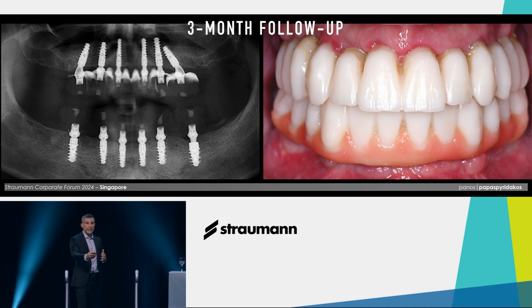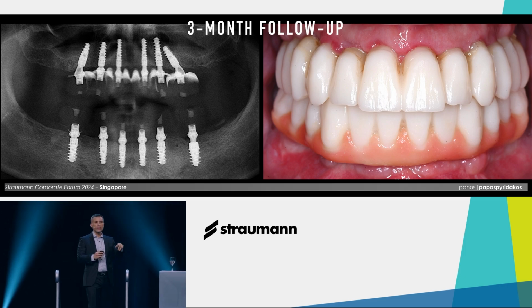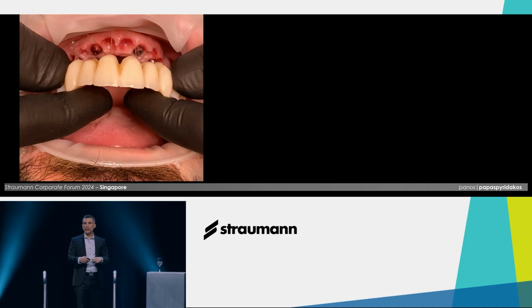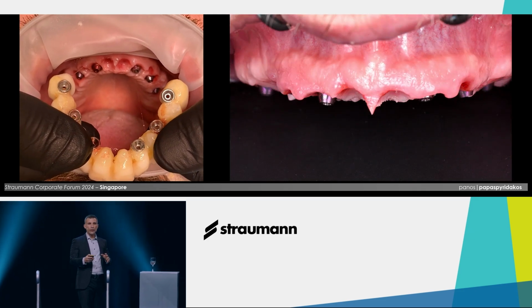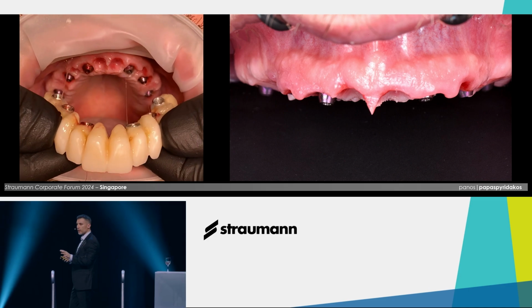So first we will take the dentate scan of the provisionals, as you see. Also appreciate the power of provisionalization and soft tissue conditioning, especially in the maxilla. That soft tissue 3 months later looks nicely scalloped nowadays. This is how it looks the moment we remove the provisional. And this is how the soft tissue looks like. You can even cut yourself with that papilla.